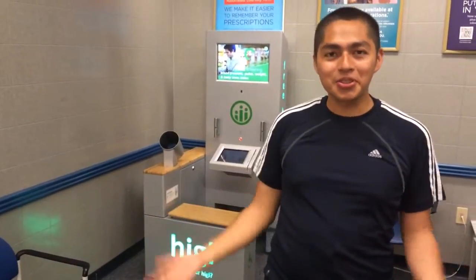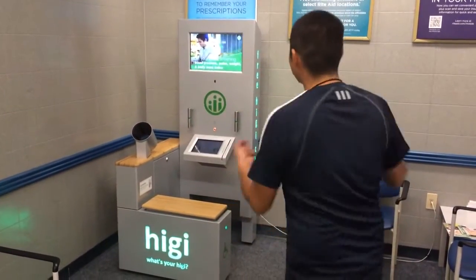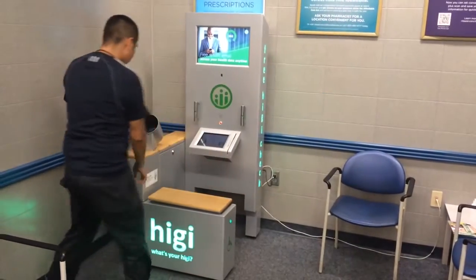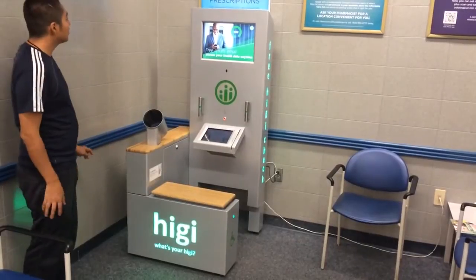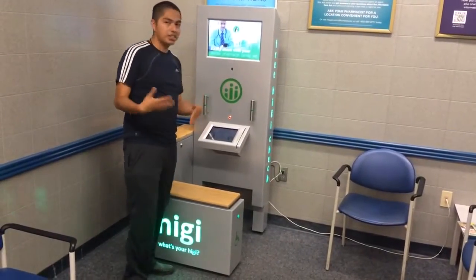Hi everyone. Today I want to introduce you to the Higgy machine, where you check your Higgy. So basically, this is a blood and weight check.